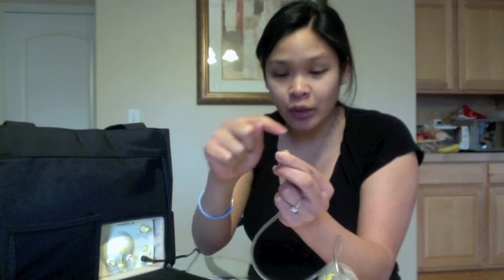If you're going to double pump, then you would use both of your valves and put one on each. But the important thing is when you put it on, make sure to put it on straight in and make sure it's secure. And the most important thing is when you pull it off, you don't want to pull it to the side or pull it back and forth. You just want to grab one end and pull it straight out, because you don't want to end up stretching or bending the plastic here. Otherwise, it's not going to have a good suction here.